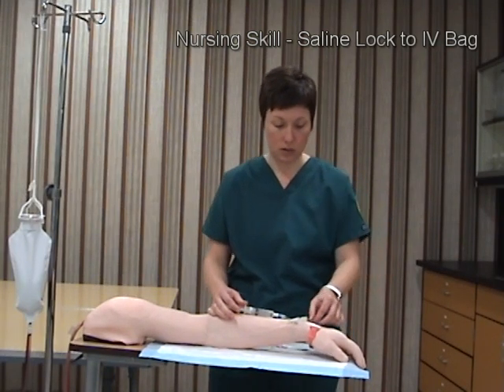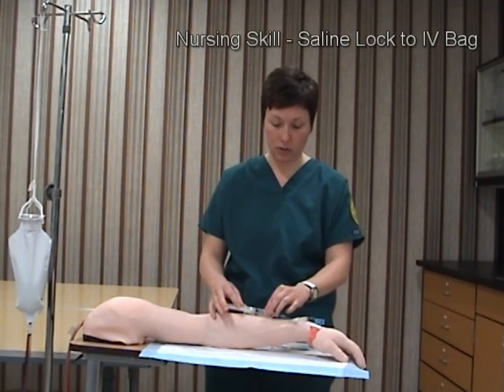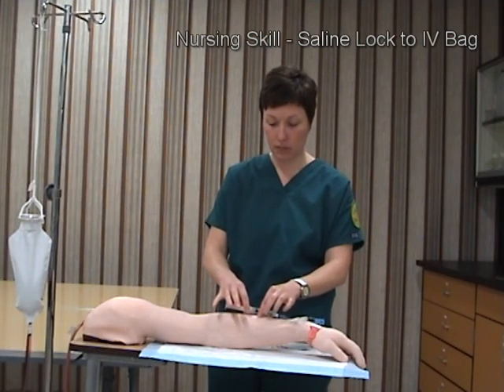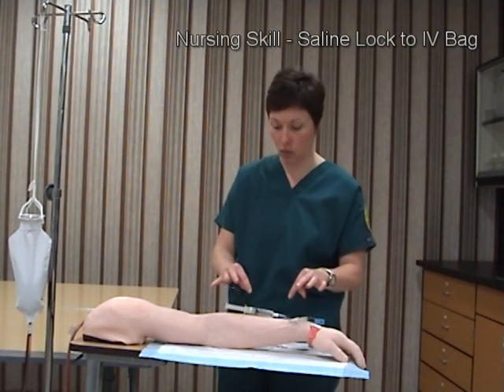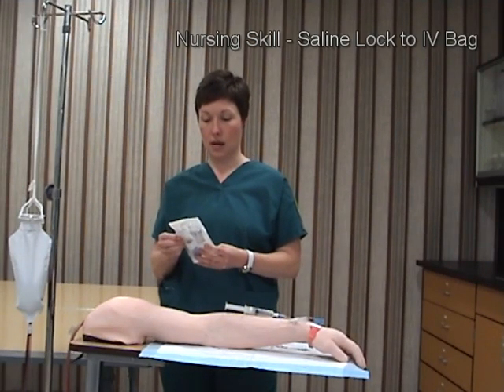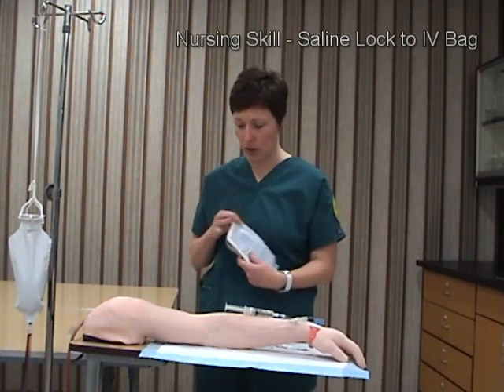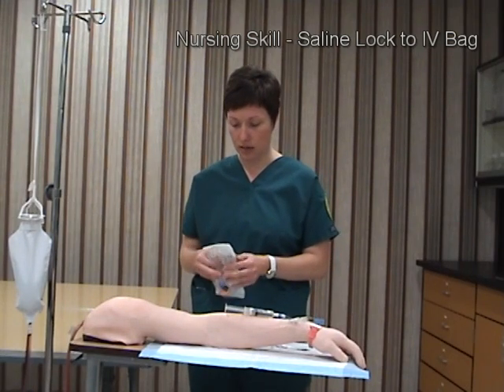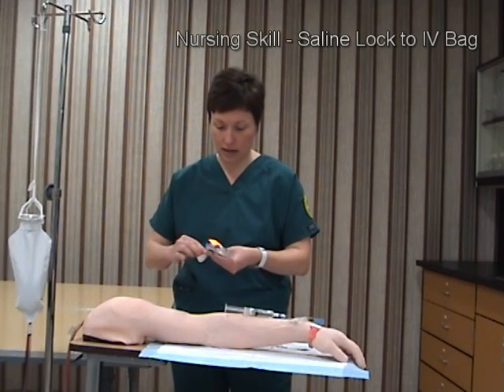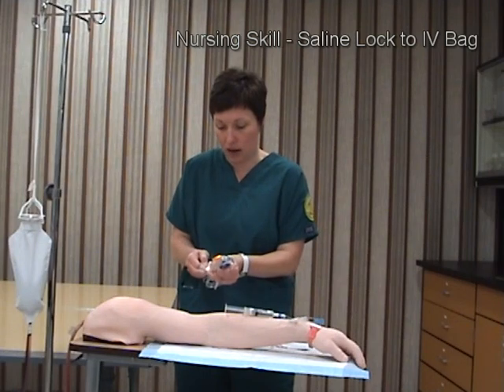I'm going to lock my saline lock and, for the purposes of keeping it clean, just keep my syringe with some normal saline on here. I'm going to grab the appropriate IV tubing, noting the drop factor on the tubing, and maintaining aseptic technique I'll open the tubing and remove the packaging.